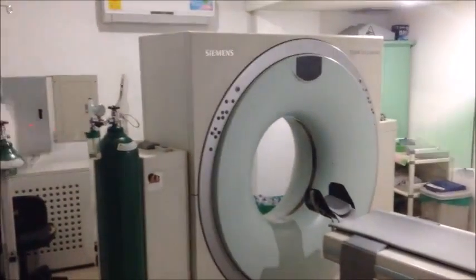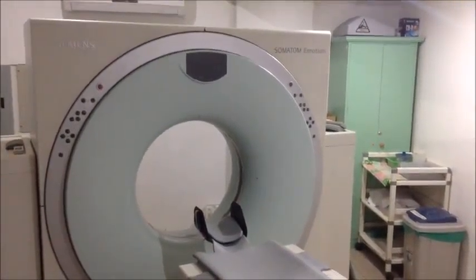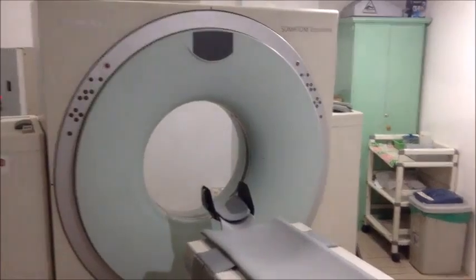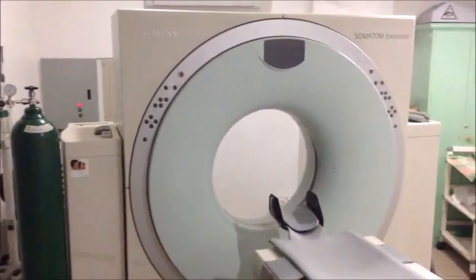A CT scan is used to define normal and abnormal structures in the body and/or assist in procedures by helping to accurately guide the placement of instruments or treatments.